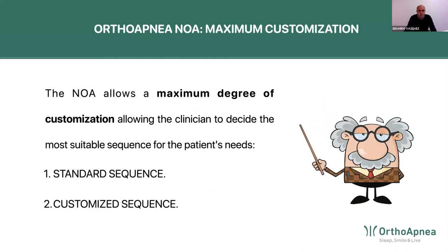Really, the NOA allows a really big degree of customization. By default, we have what we call a standard sequence. I'm getting to what we call a standard sequence in just a minute. But we can also customize the order of the NOA and customize the sequence for the treatment of our patients. This will be the standard sequence.